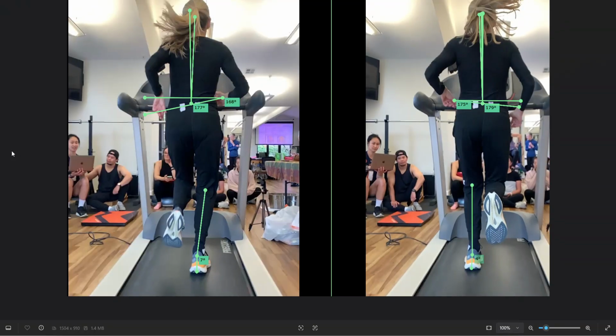And then from the posterior view, there are three metrics that you look at. The first is the lateral trunk angle, which we saw being graphed by the software itself. Then the hip drop, and then we also look at the rear foot inversion, eversion. Given the volatility of this, and the transverse coupled motion that the rear foot has with tibial internal external rotation, this is dichotomized within the Excel spreadsheet. Over 13 degrees or less than 13 degrees is being acceptable, and that's based off the current literature.